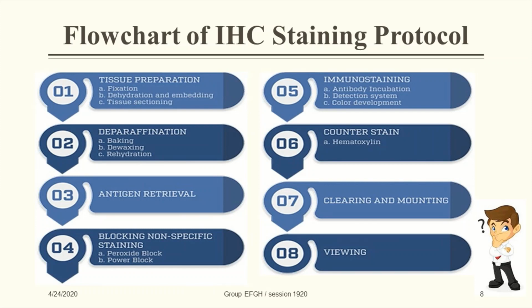Firstly, tissue preparation is collected from the subject. The sample collected has to undergo several steps, which are fixation using 10% formalin, dehydration and embedding, and tissue sectioning into thin sections. Secondly, the tissue specimen will undergo deparaffinization.